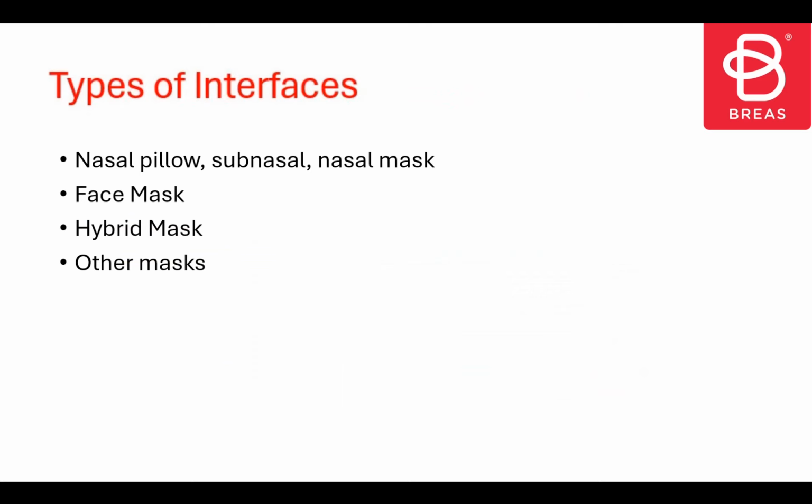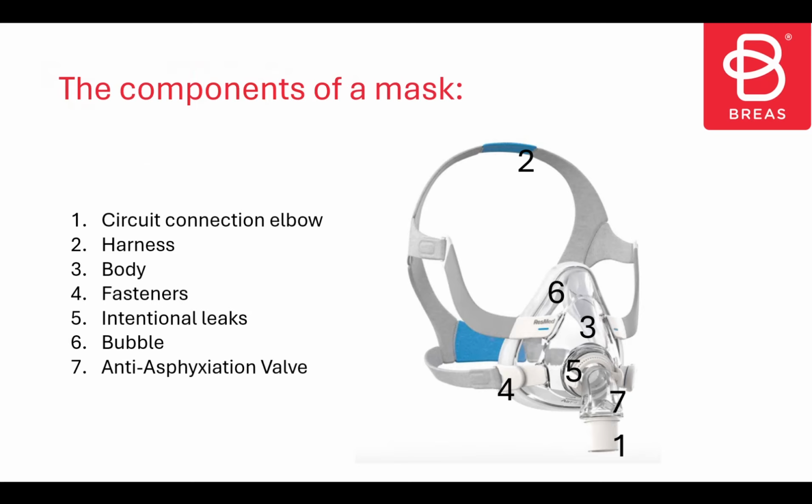There are different types of interfaces. We have the nasal pillow mask, under the nose mask, nasal mask, face mask, the mask that I called hybrid, and other types of masks. We'll see all this in detail. But before we get into the details of the types of masks, I would like to show you very quickly the components of a mask.